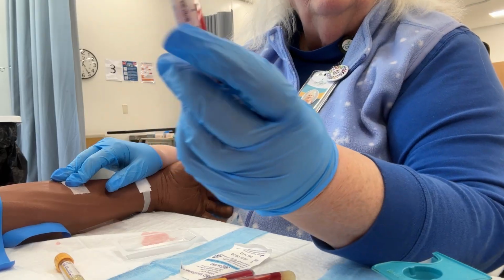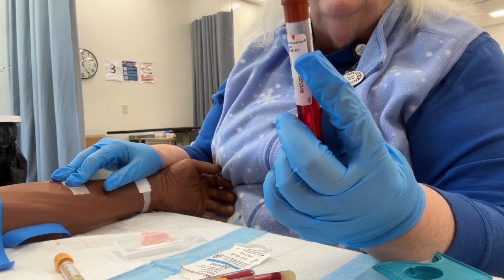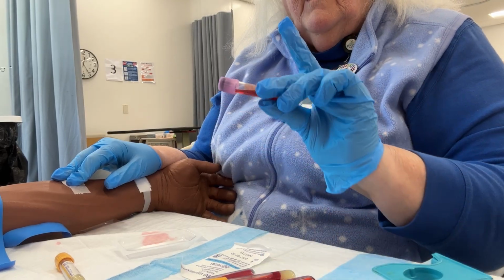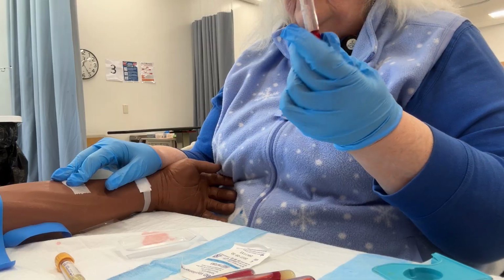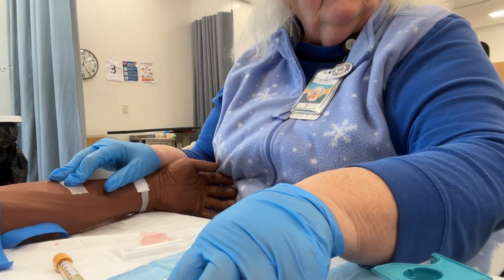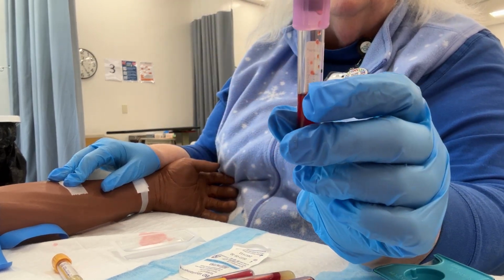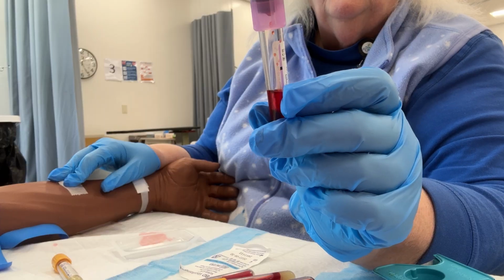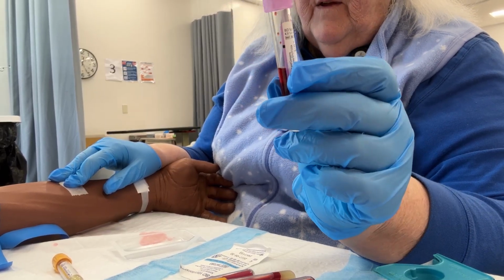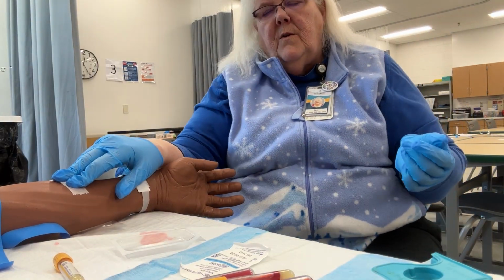Some tubes, like this red, have a mark right there where it's full, and you don't have to fill it all the way up to the writing. It's just to that line. This tube is not full. Let me see if this one is. Nope. We've been having some dud tubes today, but you would want this one full up to that black line. It's a little bit short. I happen to know on a lavender they will likely take this and be able to run the test because they only use a couple of drops of the blood. They don't use the whole thing.